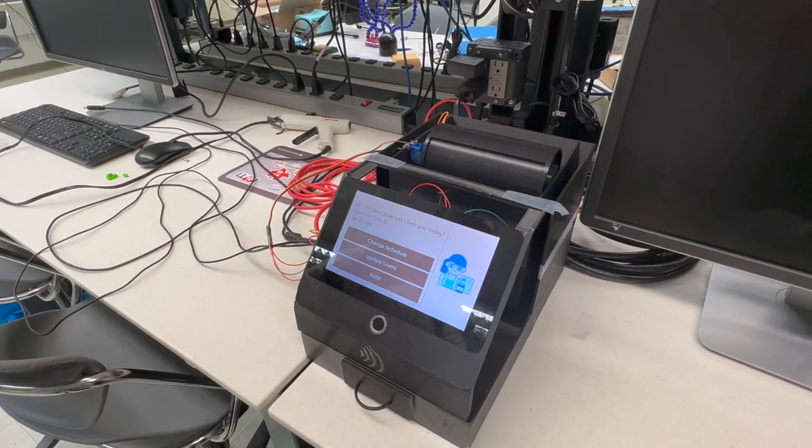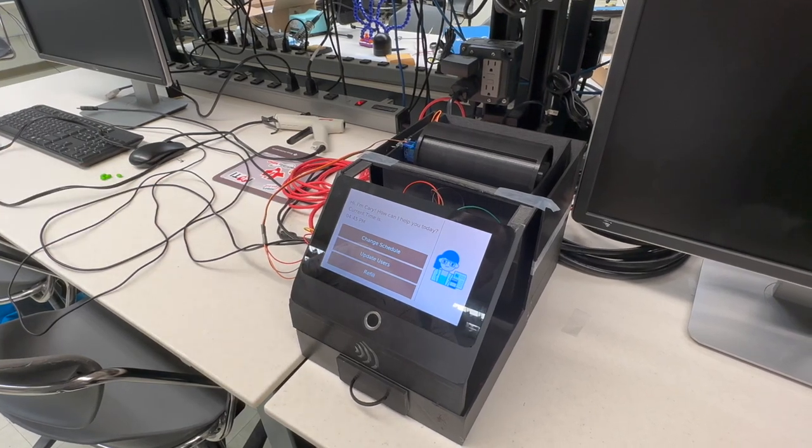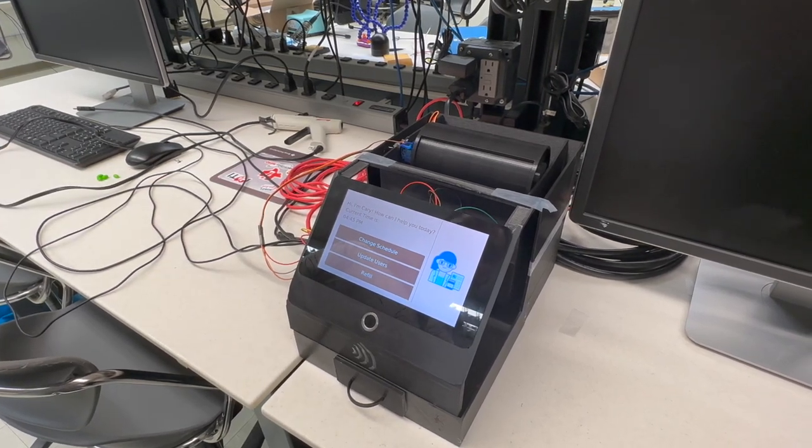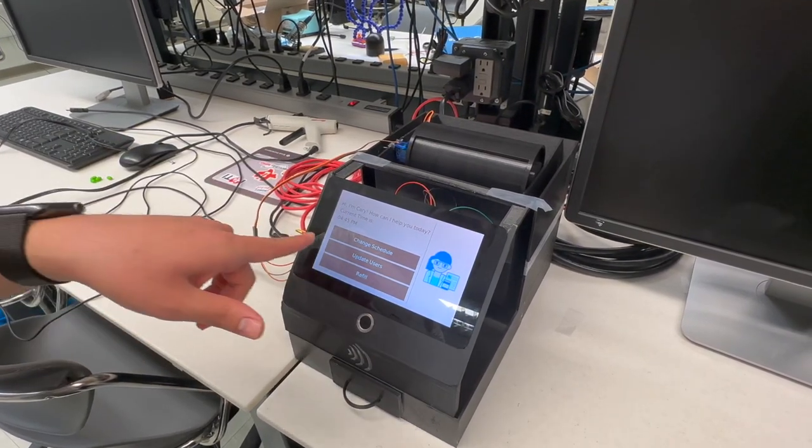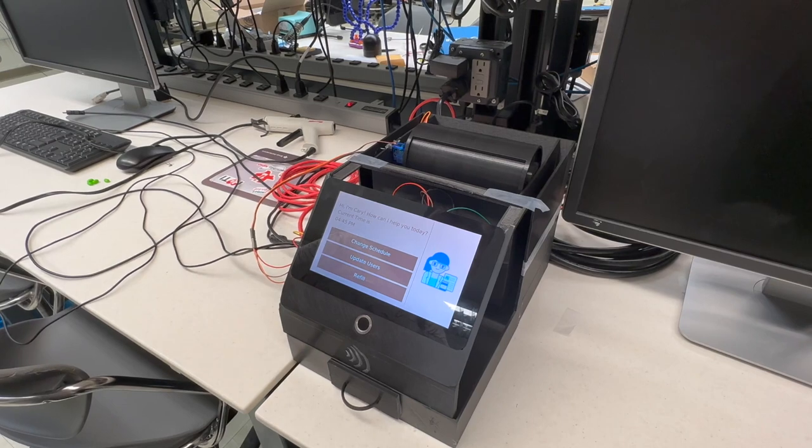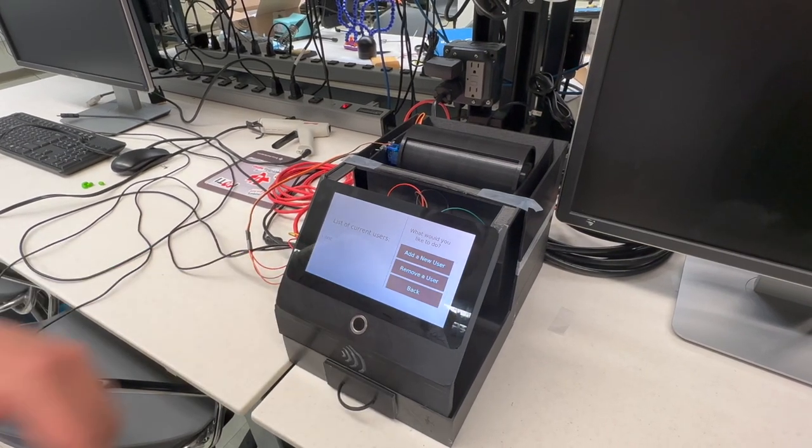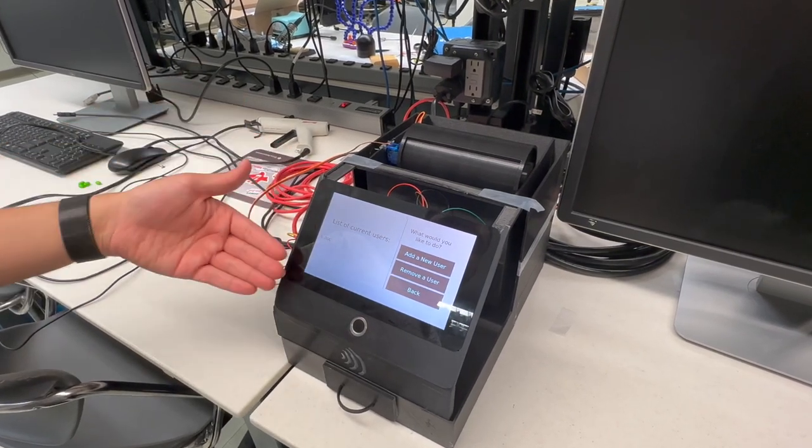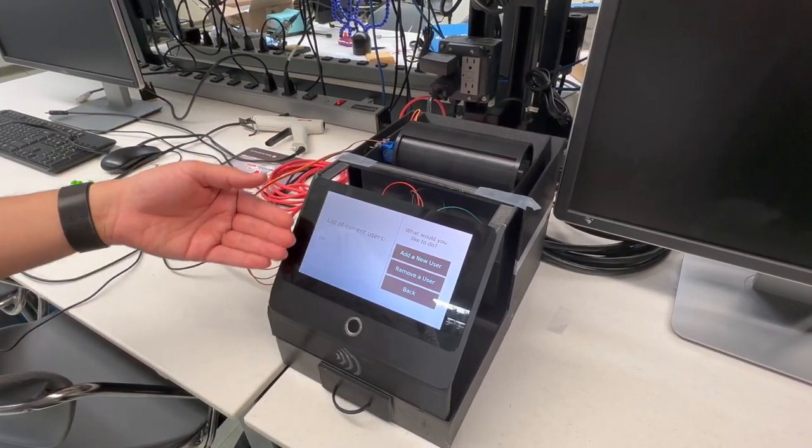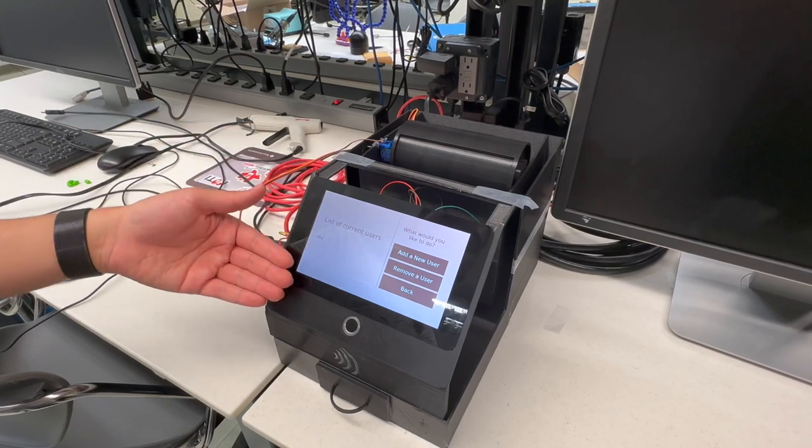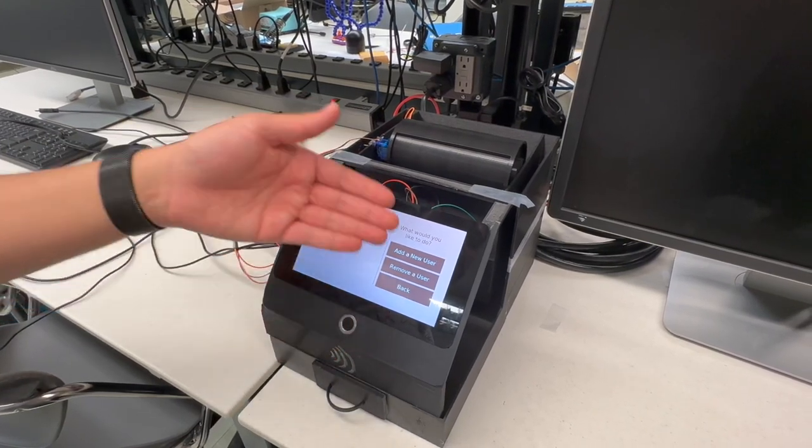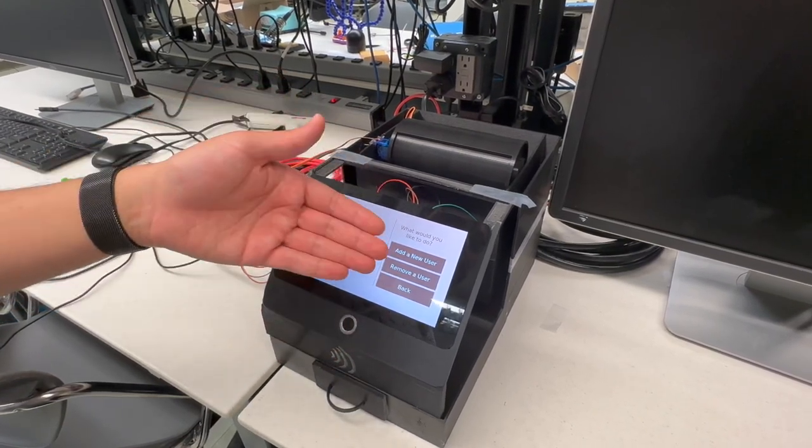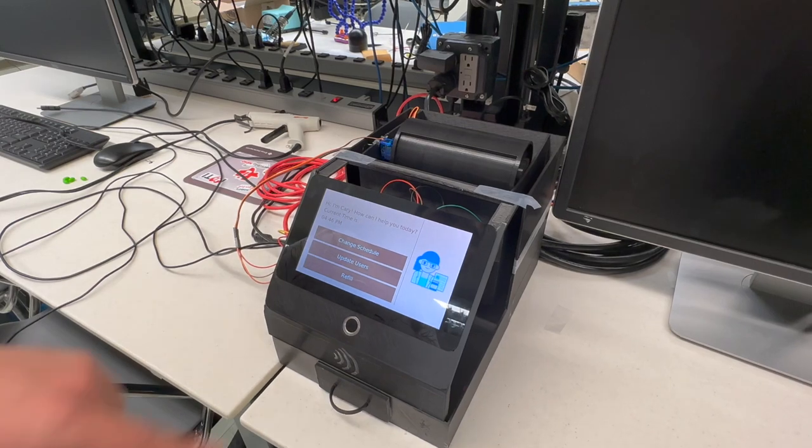When you first use the device you're going to have to register yourself as a user. On the main screen there's an update users button which lets you do that. It'll take you to this second submenu which on the left shows you the current list of users, and on the right has these three buttons to add a user, remove a user, or go back to the main menu.